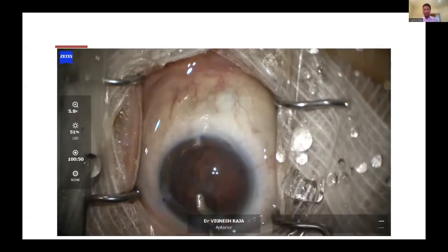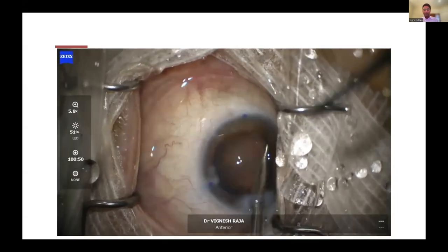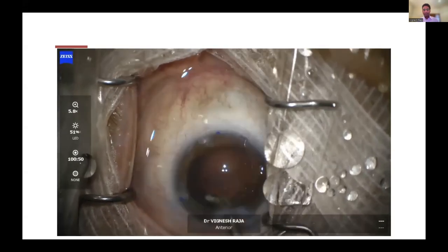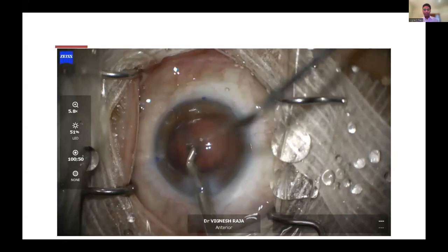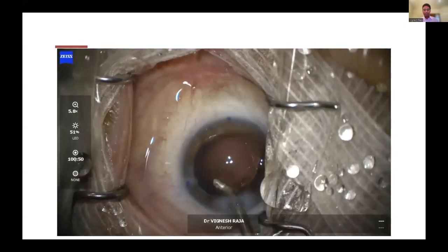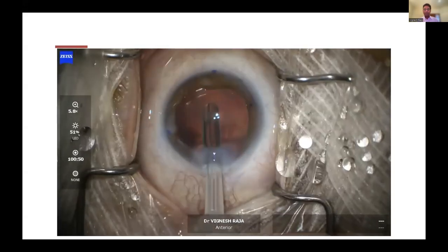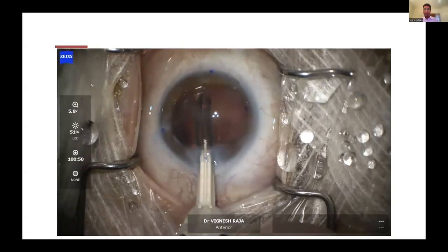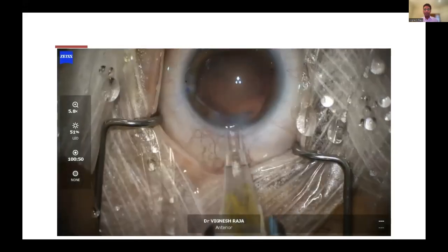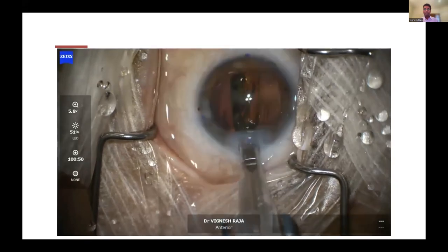All we need to do is a nice thorough IA with cortical cleaning, and then we prepare the bag for lens implantation. Here we fill the bag nicely with viscoelastic. And to stretch the bag, you put a capsular tension ring because you want the bag to stay as expanded as possible. So I've injected the capsular tension ring, and here goes the toric intraocular lens.